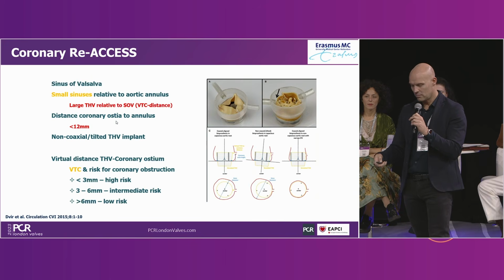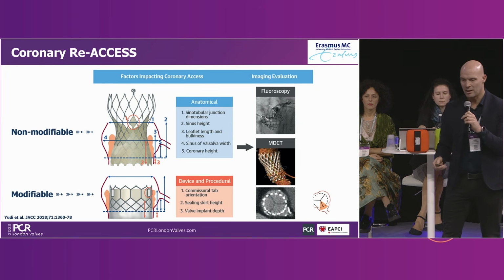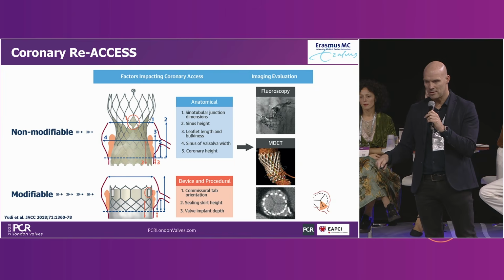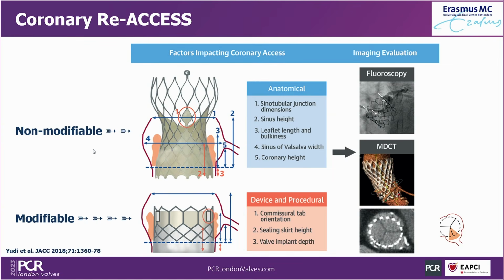The second important anatomical landmark is the sinus itself. In terms of sinuses, the most important aspect is the dimension. The wider the sinuses, the better it gets. I am very comfortable if the sinuses are wide. I'm not so much concerned about the framework.